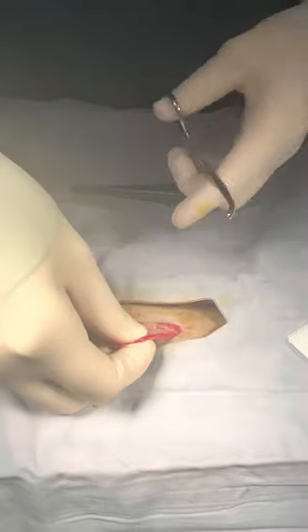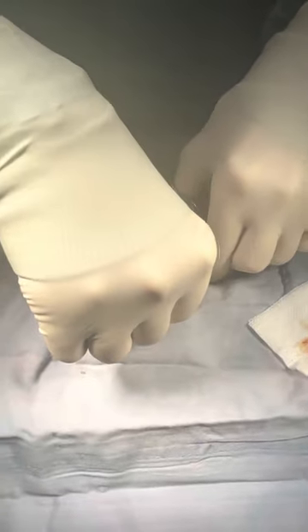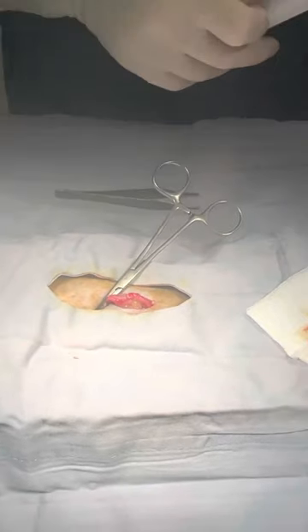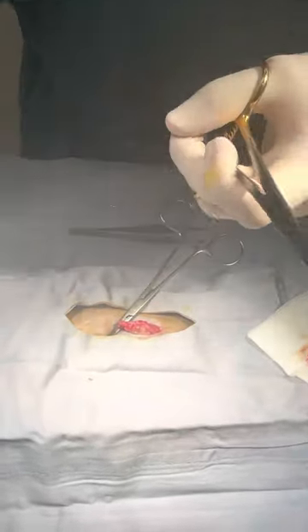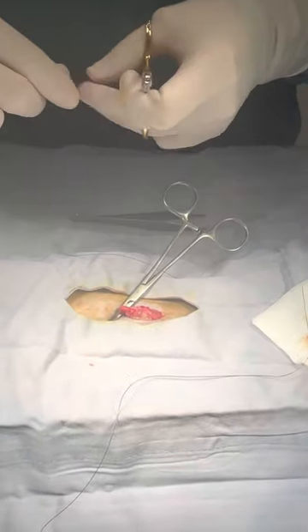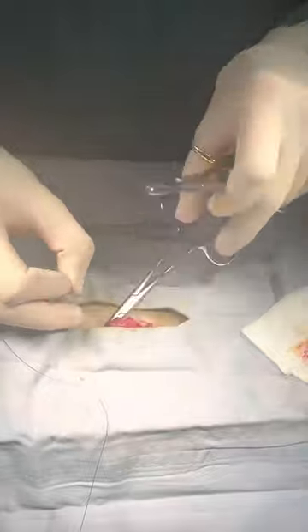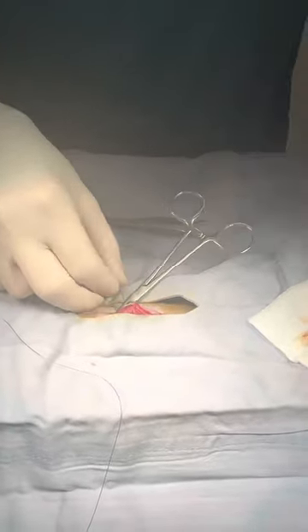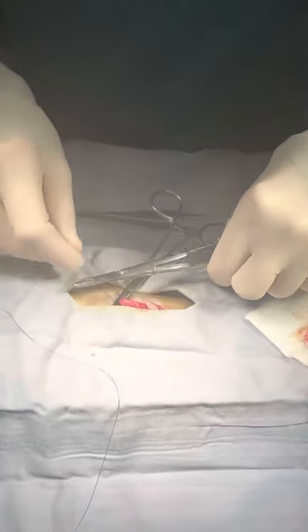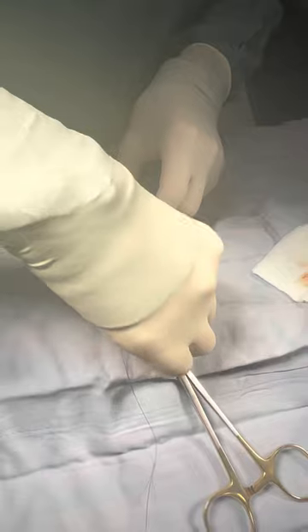The first thing we do is make sure that we ligate all of the blood vessels because, as you can see, this is a fairly vascular area and we do not want to have any issues with bleeding. So we go ahead and get a hemostat on the pedicle blood vessels and then take our suture and ligate the area. I'm going to use a miller's knot in this case. Just like in all surgeries, it's a lot easier to do surgery on a patient who isn't fat, because fat really affects visibility and gets in the way of a lot of organs and structures.